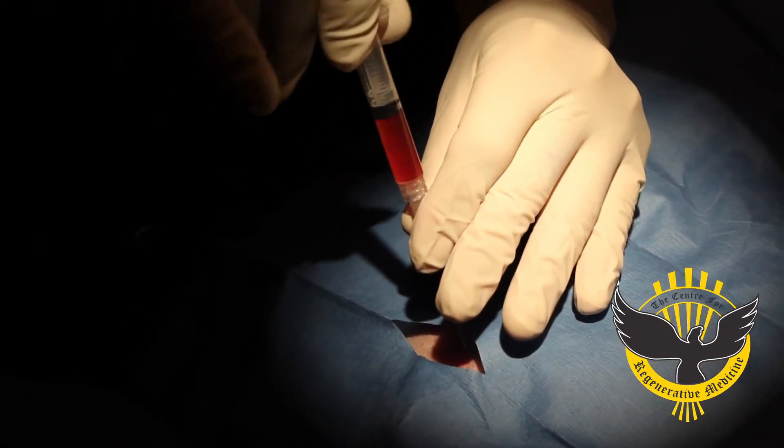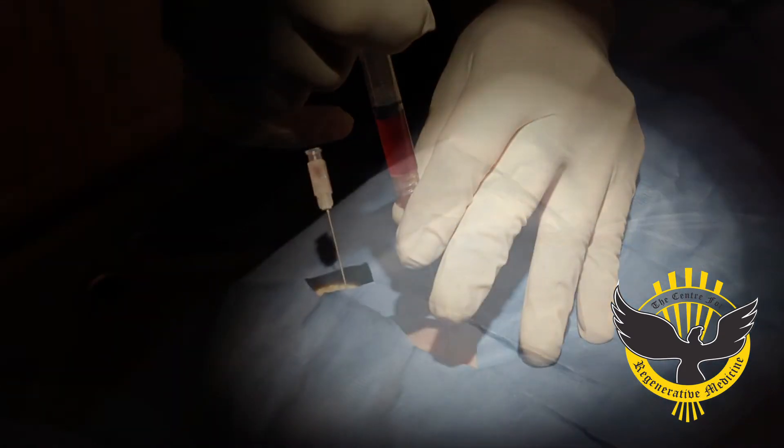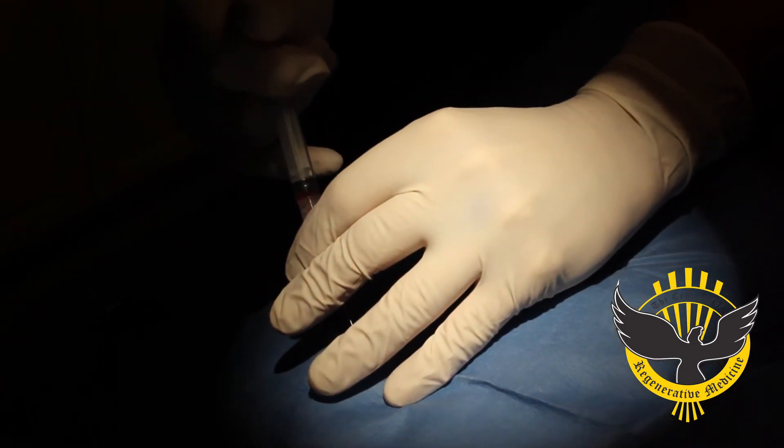The third part of the procedure is the injection or the delivery of the cells into the lesion. In this dog with the hip dysplasia, we are injecting the cells directly into the hip socket to facilitate healing.